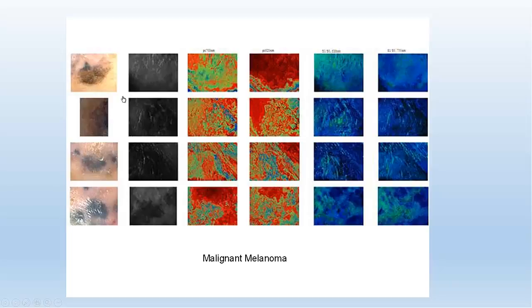So here is an example. This is a wide view of a lesion. This is the image taken by a dermatoscope, for example. It's a simple image, but just a small part of this lesion. And you see here that the Dosi algorithm, I won't get into it too much here, but various Dosi algorithms can produce information about the underneath distortion.